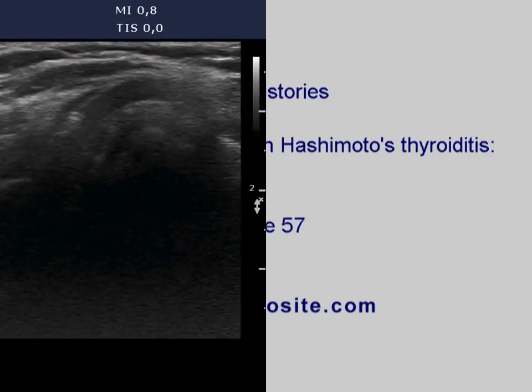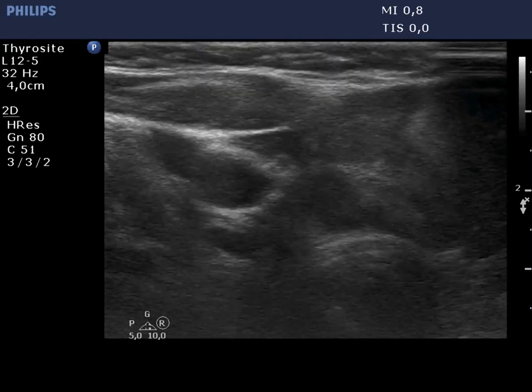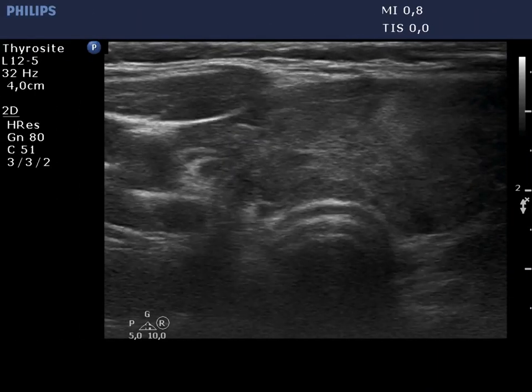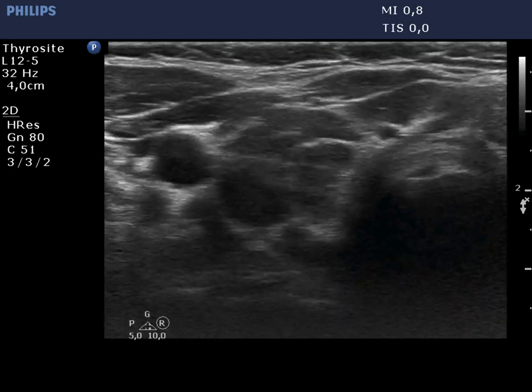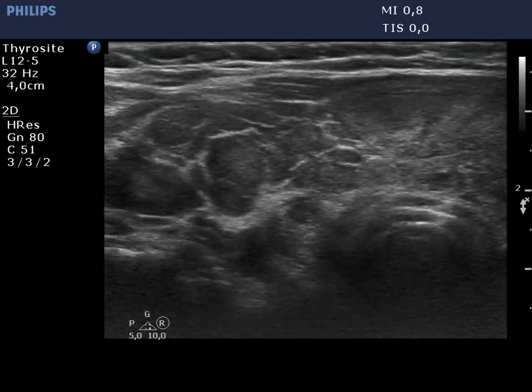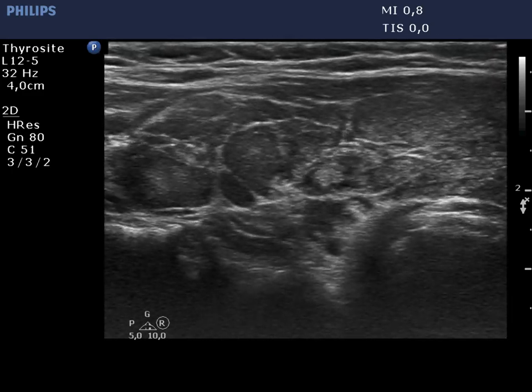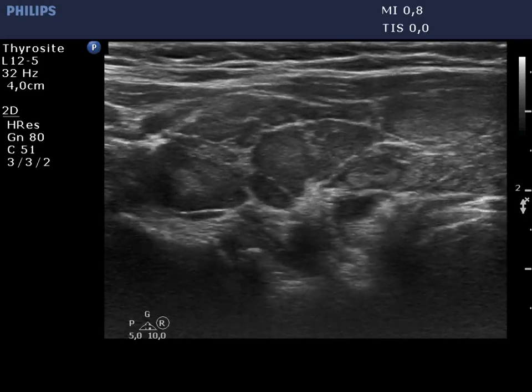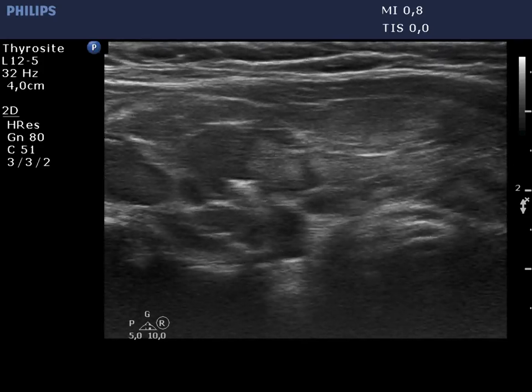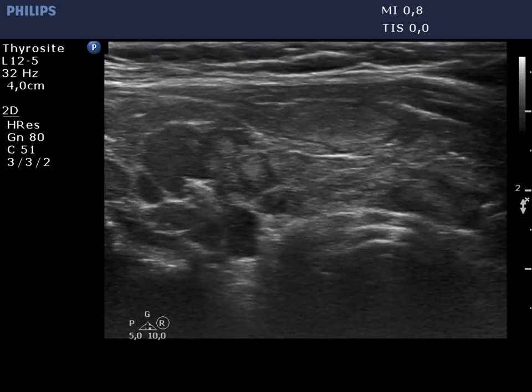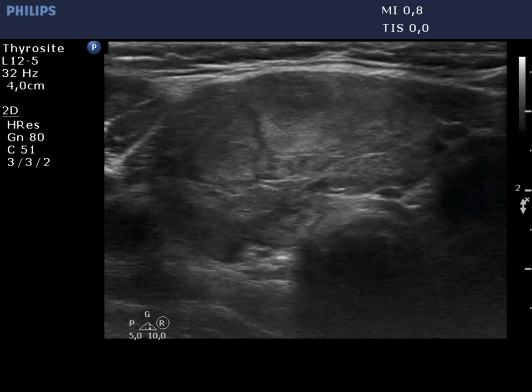The right lobe is composed of hypoechoic discrete lesions divided by connective tissue. These lesions have irregular shape and borders, and none of them fits a pathological nodule. The lower part of the lobe contains echotextured normal tissue.